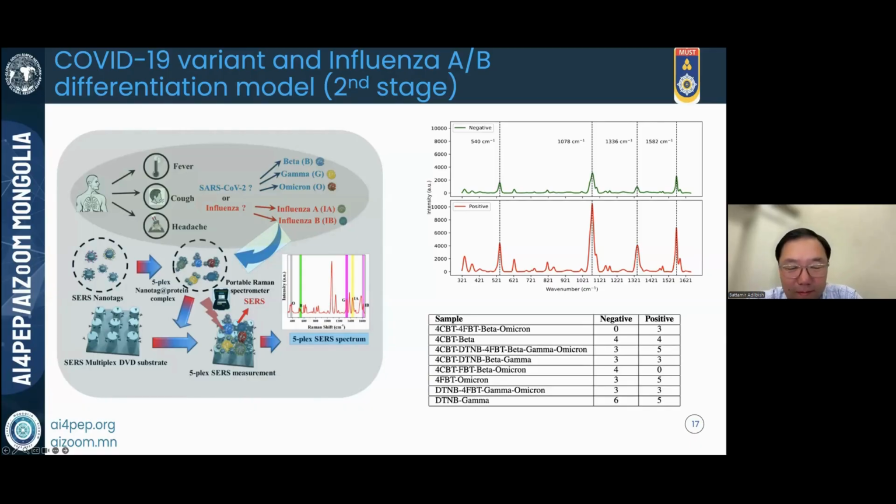So what is the limitation of this technique? It seems a miracle. I can't answer about the limitations on the medical side, but technically it opens a lot of possibilities because it's very portable. It can be just a small portable device that can detect viruses and their variants anywhere. Technically, there is no limitation.